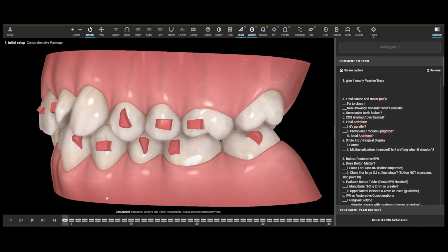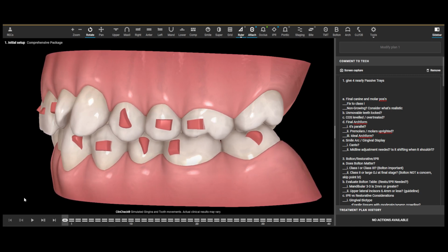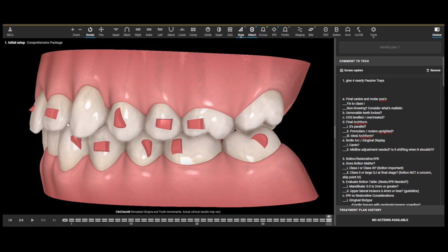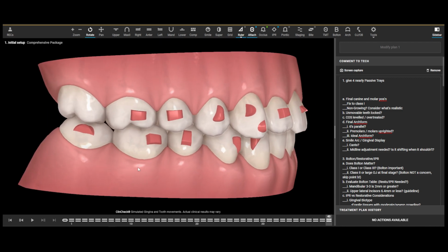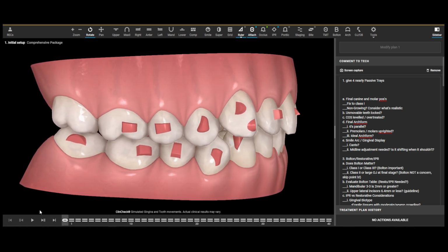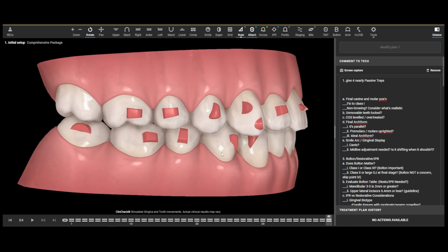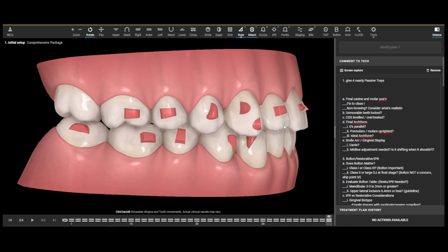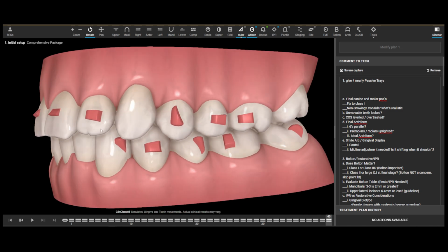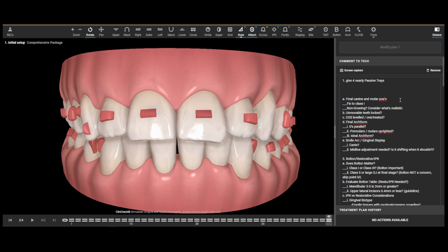So we don't have to fix to class 1, but do we want the patient to be in class 1 at the end? Well, yeah, absolutely, because she's in class 1 at the start of treatment. So it would naturally make sense that she should be in class 1 at the end of treatment. Now we're maybe slightly class 2 on the right side here at the end of treatment, just ever so slightly. But all in all, I'd say that this patient's pretty close to class 1 on both sides. Not a lot of changes need to happen. So we're happy. Nothing needs to change. Just delete the line and move on to the next thing.